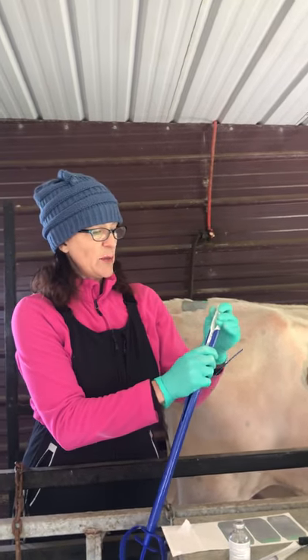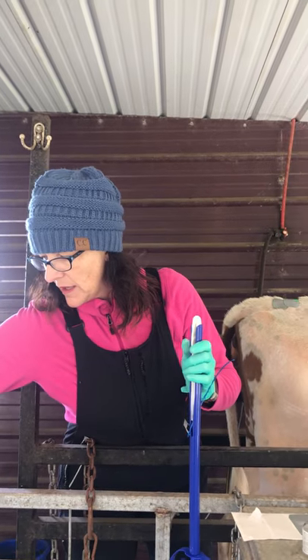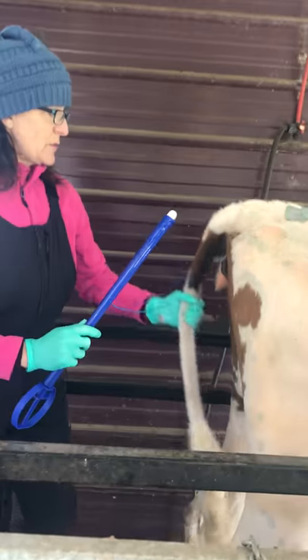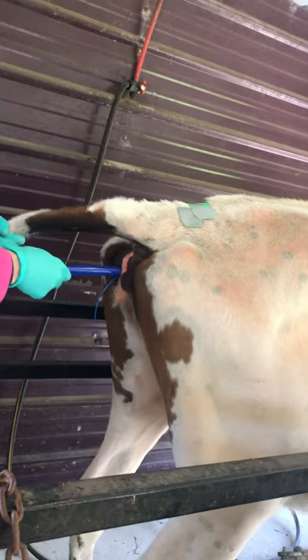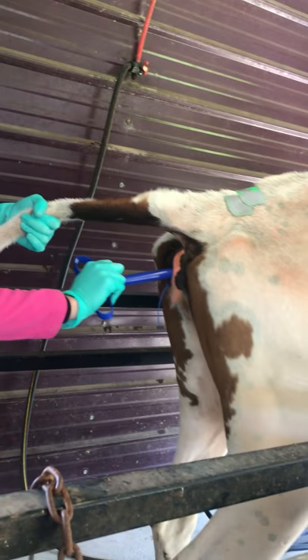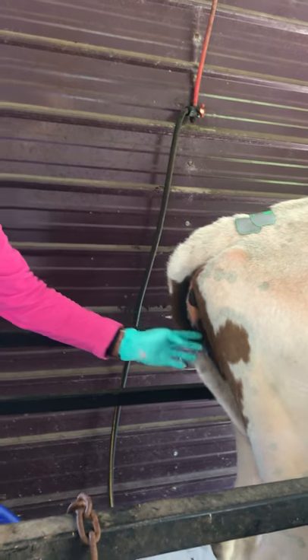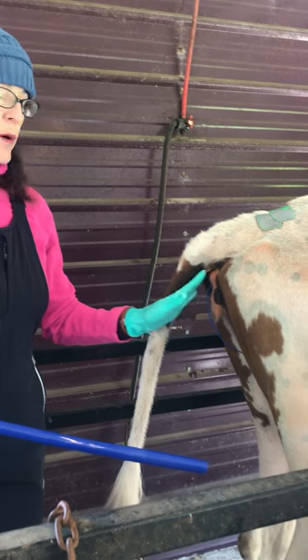So now I'm going to reload it and put some lubrication on it, because that would be kind. Put a little bit of lube on it, and all I'm going to do is push her tail over — you have to go up at an angle; you don't want to try to go into her bladder. Then there's a little pop over the brim of her pelvis and I'm going to just push it in. I'll take my gun out, and there's this long string which we'll cut off a little bit. We'll leave that for seven days.